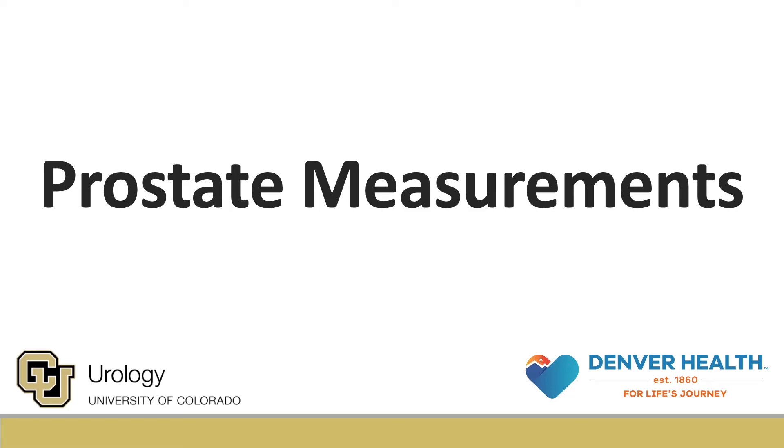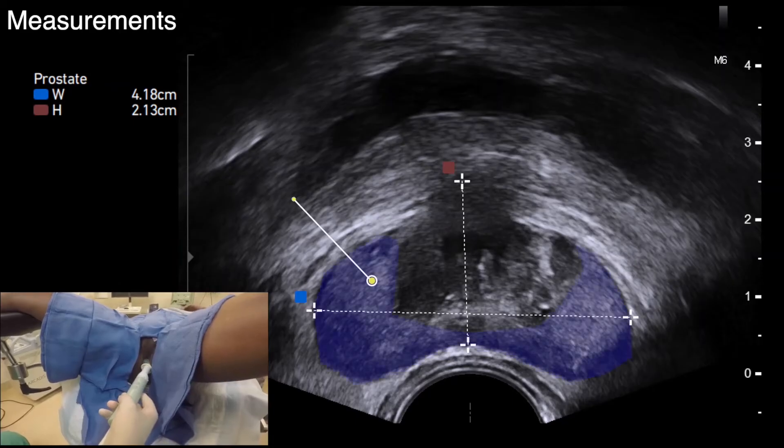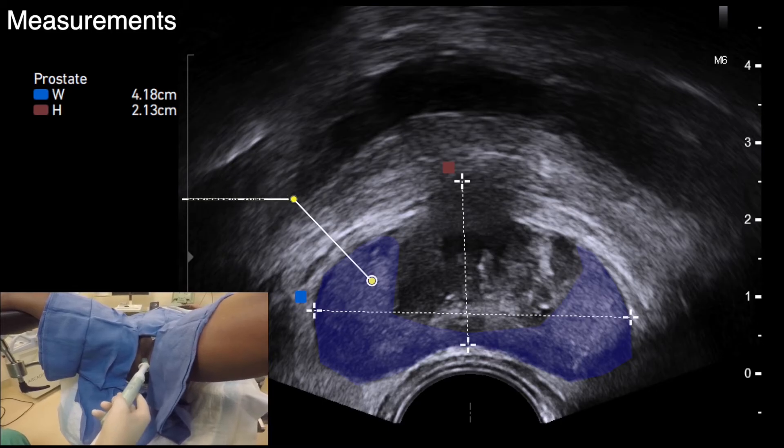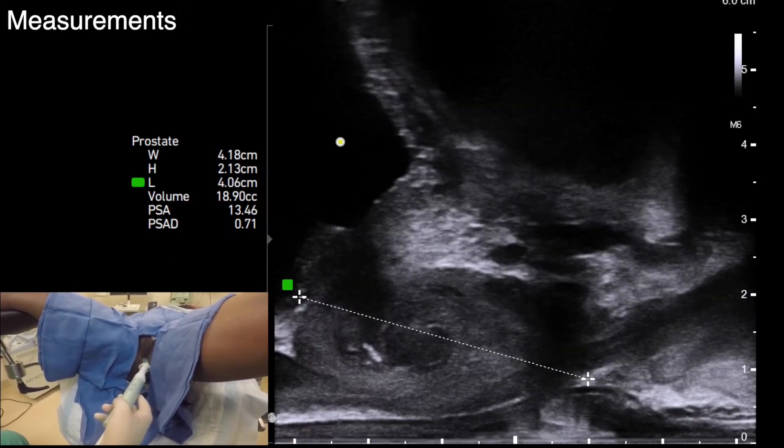After the patient is placed in dorsal lithotomy, a digital rectal exam is routinely performed before placement of the probe to assess the prostate. We measure the prostate size in an axial and sagittal view.